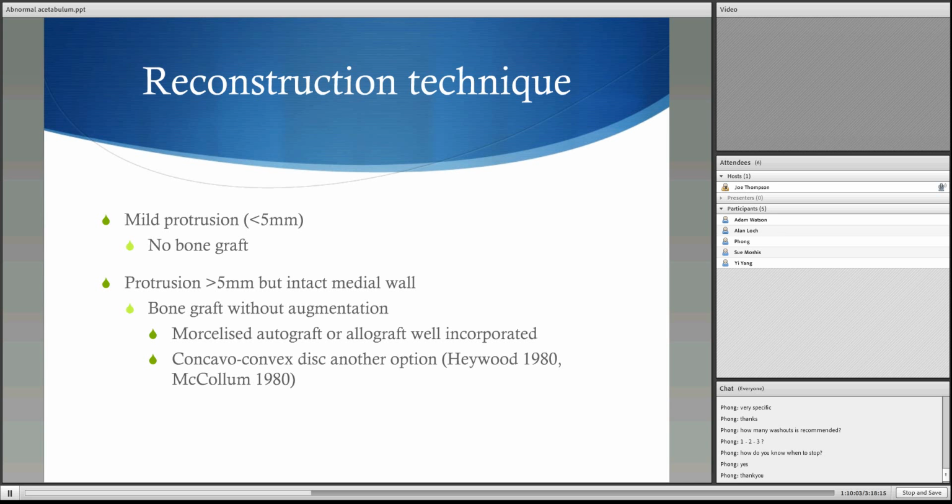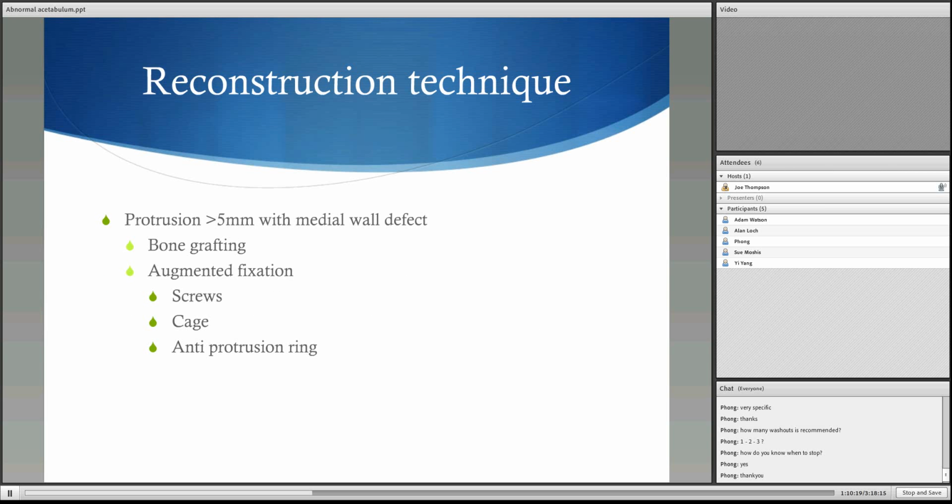Where it intersects, the starting point is 5 millimeters lateral to that. Going perpendicular to this horizontal line, up 1/5 of the height of the pelvis, and then from there going the same amount across, forming an isosceles triangle, and that's the anatomical location of where the hip should be with the reconstruction.